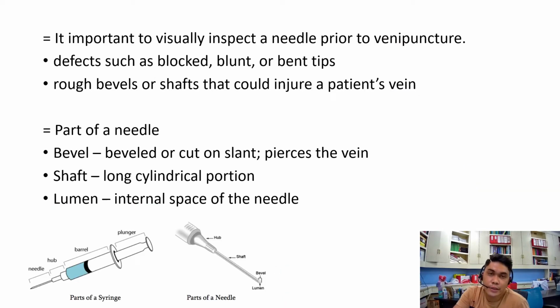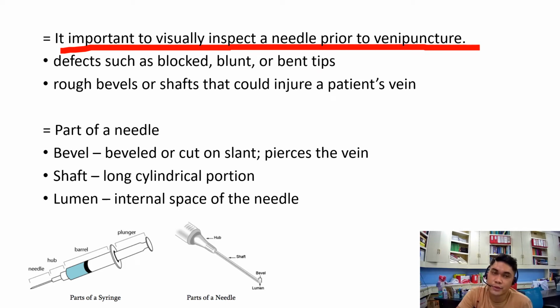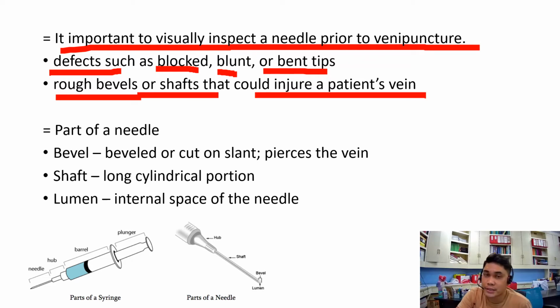So it's important to visually inspect a needle prior to venipuncture. Inspect defects such as blocked, blunt, or bent tips and rough bevels or shafts that could injure a patient's vein.